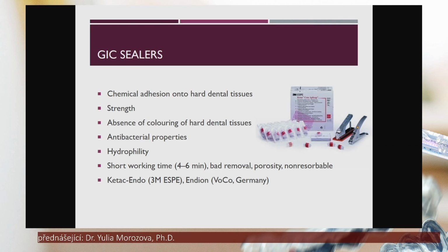This disadvantage is that they have really short working time, up to 6 minutes, and once they are hardened, it's impossible to remove them because they are really hard. They are non-resorbable, so almost no solvents are effective against these sealers. As representatives, we can, for example, say about Ketac Endo or Endion.